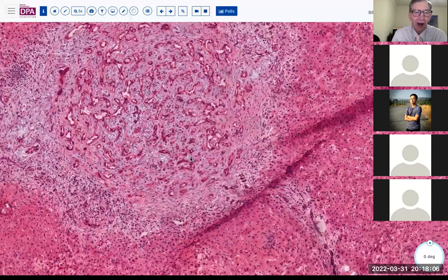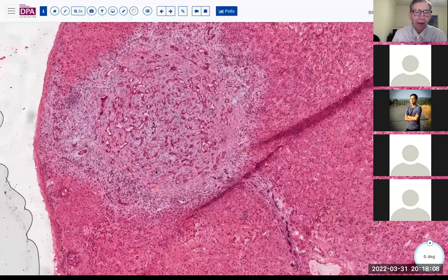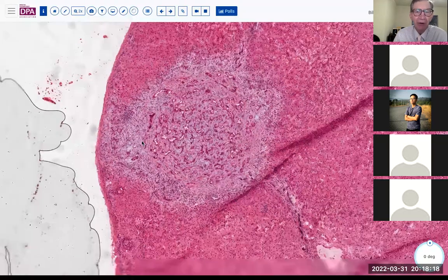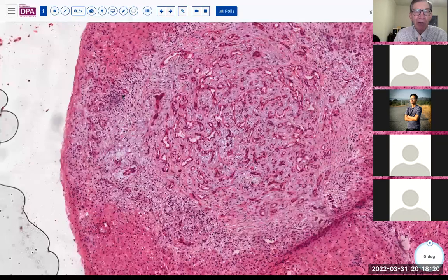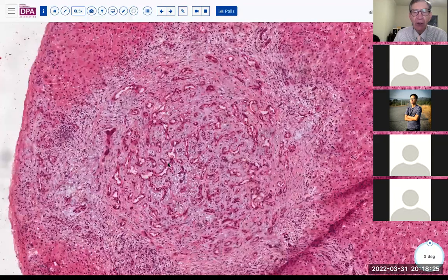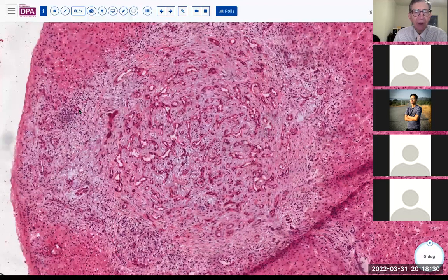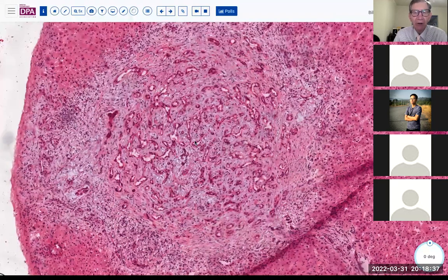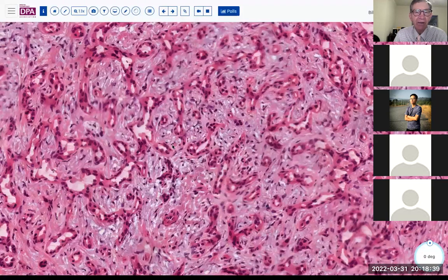It's a difficult call. It's a difficult finding because you don't get a good shot at this with optimal histology on frozen section. Now, what are the helpful features? Well, the rounded architecture could be seen in either a metastasis or a bile duct adenoma. The inflammation could be seen with either. And there's a degree of disorder here. It's not totally normal looking ducts.